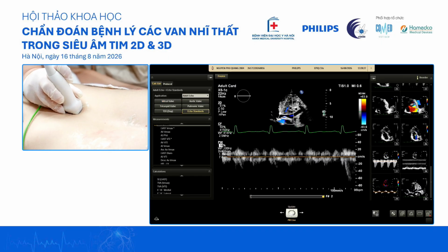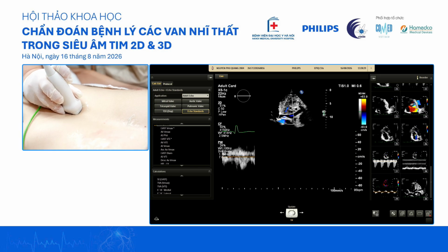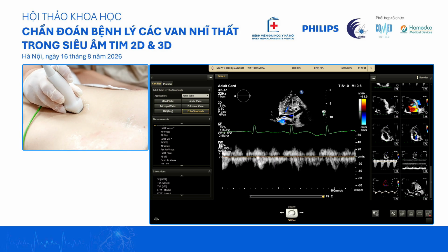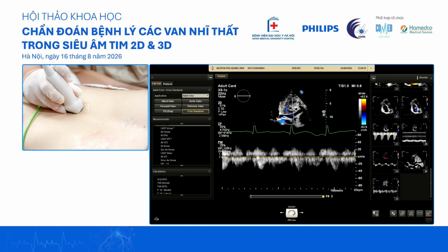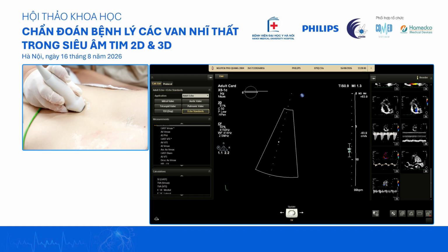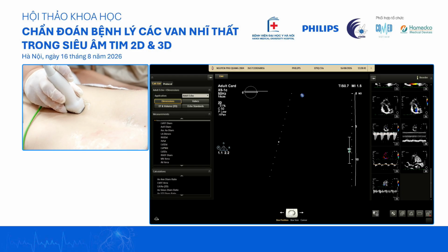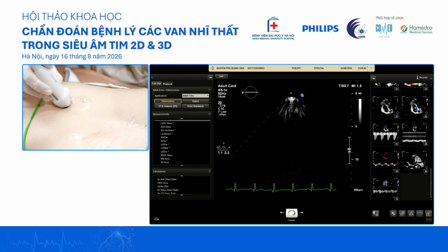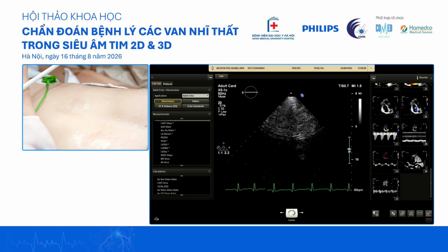Chúng ta cố tìm xem có dòng đảo ngược ở tĩnh mạch gan không, do đây là một yếu tố quyết định mức độ hở van. So I don't see any reversals in the hepatic vein. Không thấy. And from the color Doppler, it also does not look like it's severe regurgitation. We will see on TEE as well.